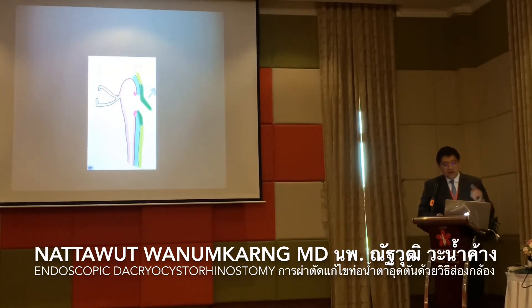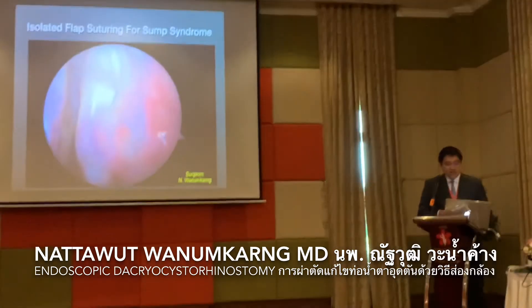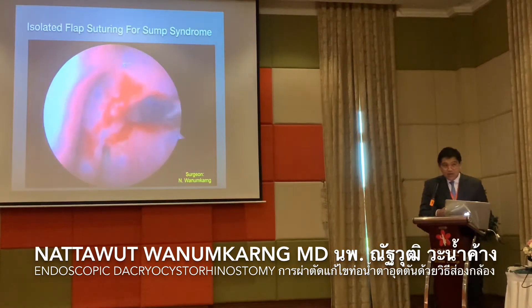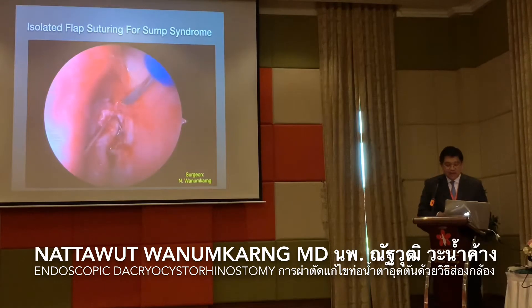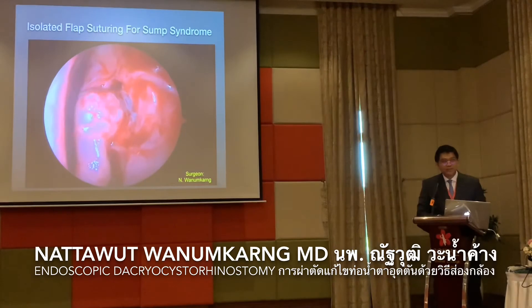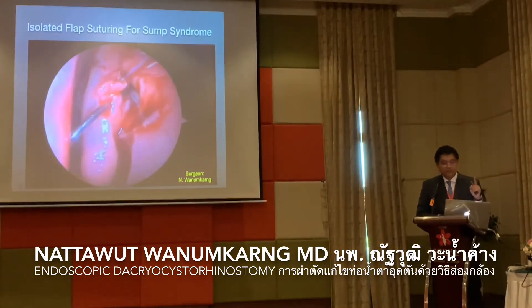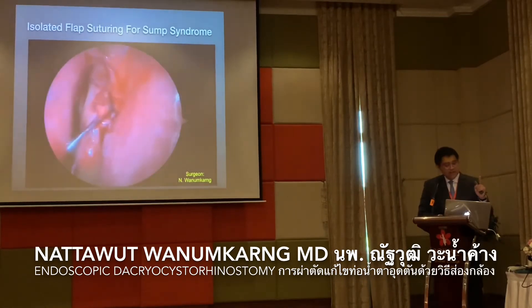The diagram shows the isolated flap. Sometimes when you cut into the scar tissue of the flap — because of some syndrome — inside there is good healing but there is only a small opening on the nasal side. With one simple vertical cut and then rotating the flap posteriorly, within only one simple maneuver, two sutures for the posterior flap can help this patent opening survive in the revision case. This has helped me many, many times in my practice.